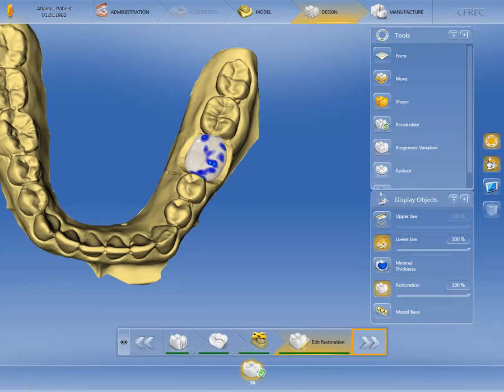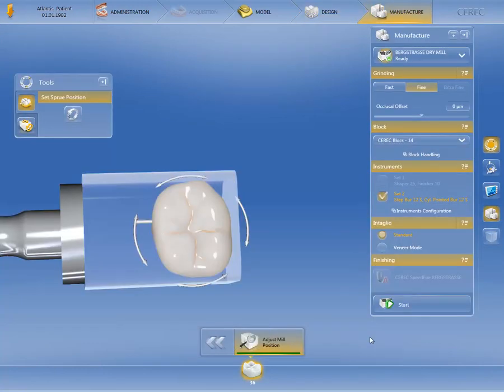In this phase, you can use the tools to correct the location of the sprue or realign the position of the restoration within the block. In the window, under Manufacture, you can make further modifications.